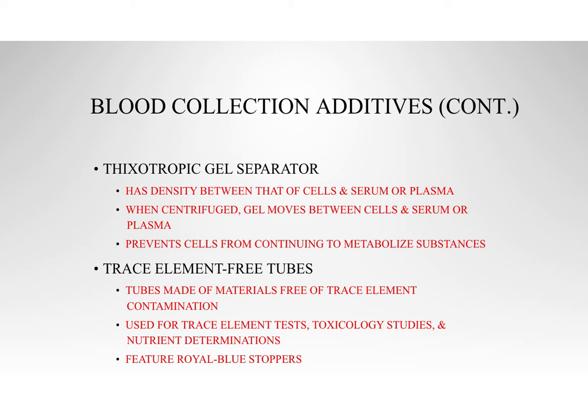All I want you to know for this one is that they're tubes made of materials free of trace element contamination. Okay, we're really going to talk a lot more about these later, in that other lecture where we get really deep into the tubes, okay? So what are trace elements?